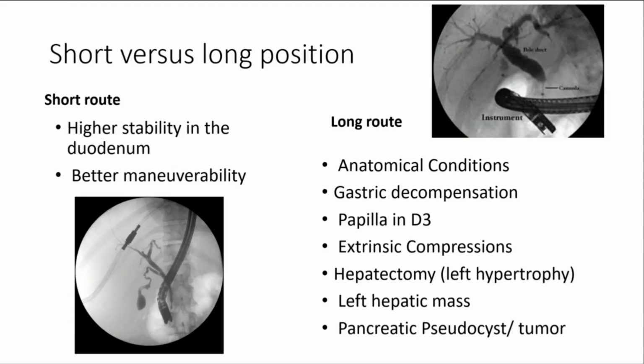It's not easy to get the right position in front of the papilla that I showed at the beginning. This may require pushing the scope to make a big loop inside the stomach, and you have the long route.